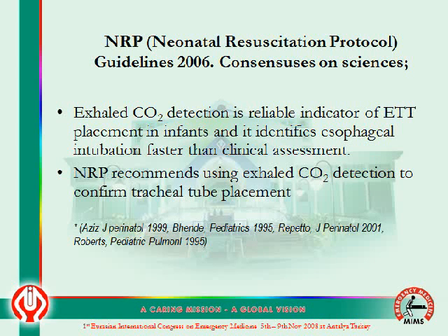The NRP, that's the Neonatal Resuscitation Protocol guideline in 2006, and their consensus on science state that exhaled carbon dioxide detection is a reliable indicator of ETT placement in infants, and it identifies esophageal intubation faster than clinical assessment. NRP recommended using exhaled carbon dioxide detection to confirm tracheal tube placement.